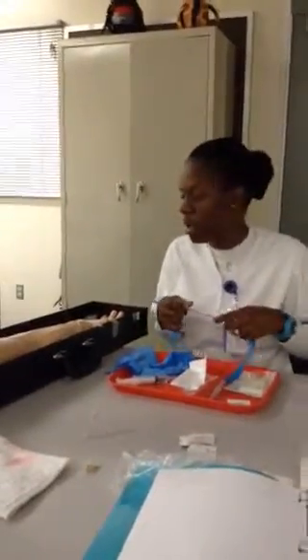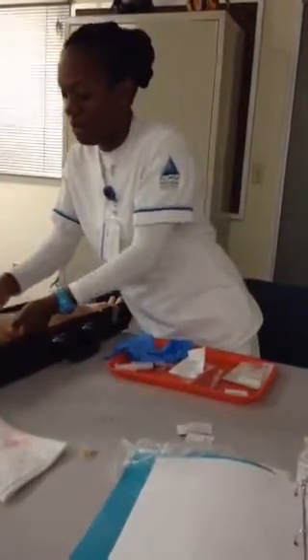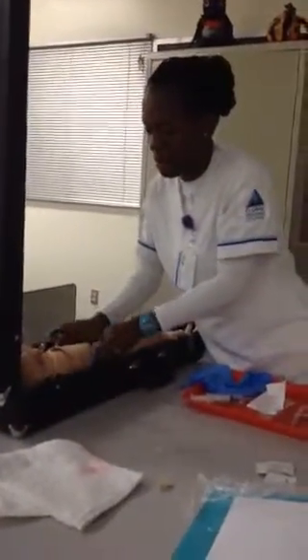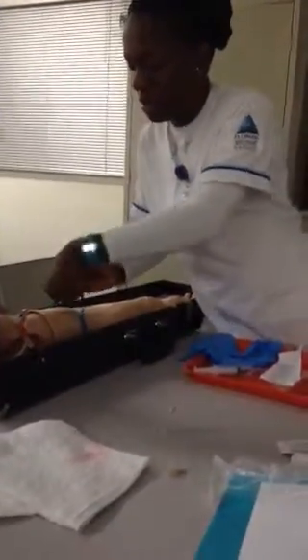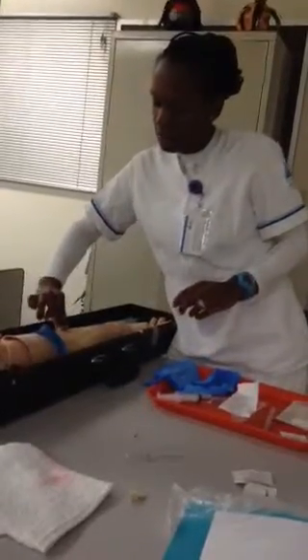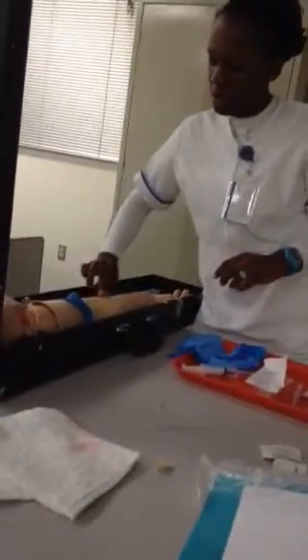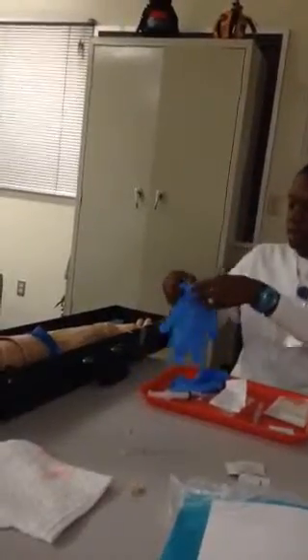I'm going to apply the tourniquet, which may be a little tight. I'm going to go about six inches above the actual site where we're going to apply the IV. It'll be a little stick, but I'll let you know before that happens. I'm going to assess the site again — it's spongy, and the vein seems big enough for the needle. Once we do that, I'm going to apply gloves.